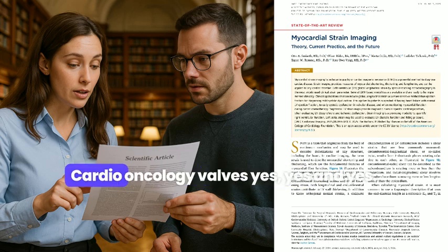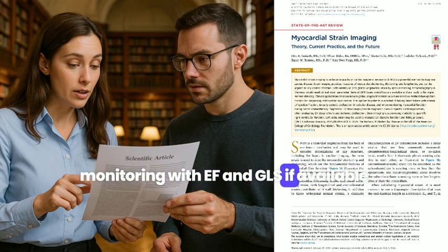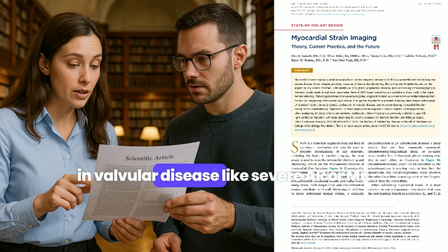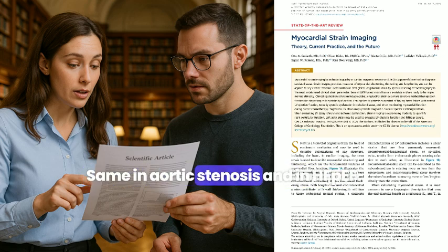Other conditions, cardio-oncology, valves, HFpEF. Yes, yes, and yes. Cardio-oncology guidelines recommend monitoring with EF and GLS if available, as GLS can detect toxicity early. In valvular disease like severe AR or MR, GLS can show subclinical LV dysfunction despite preserved EF and predicts post-op outcomes. Same in aortic stenosis.